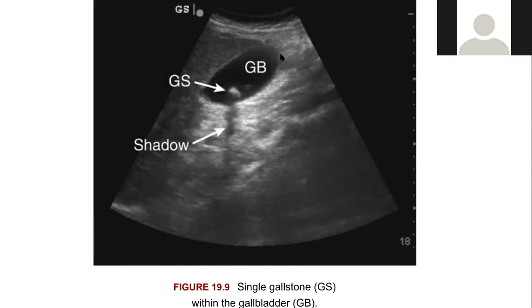What's the head then? That doesn't matter. Okay. Where's the fundus here? Where's the fundus? I don't know, man. Where your arrow is? Get your landmarks right. Where's the anterior?